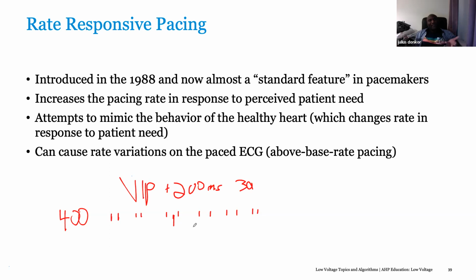So Medtronic has AAI to DDD, Biotronik is DDD ADI. I was explaining to Elvis the other day, and Boston it's called Rhythm IQ. Rhythm IQ does what VIP does and MVP does.